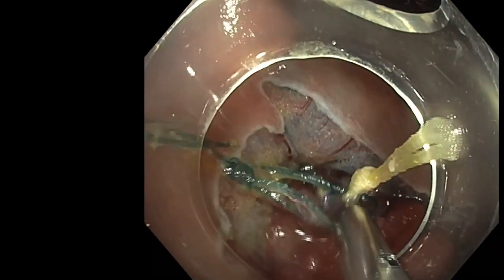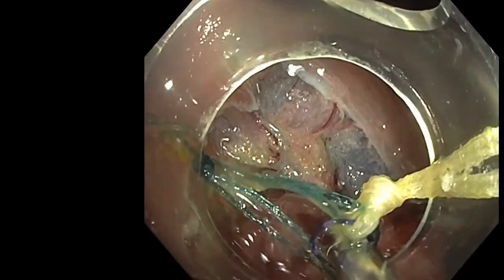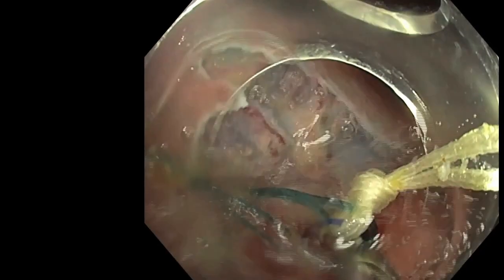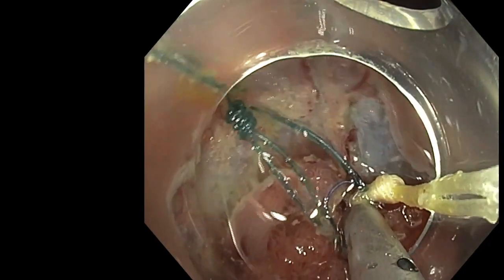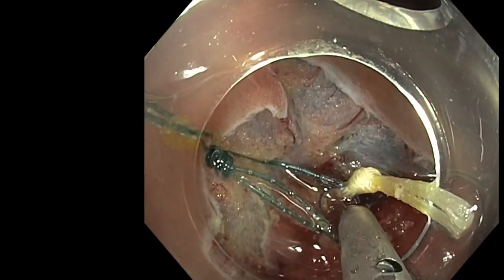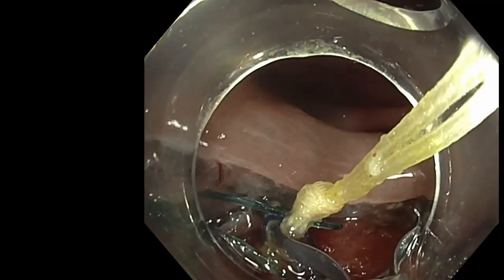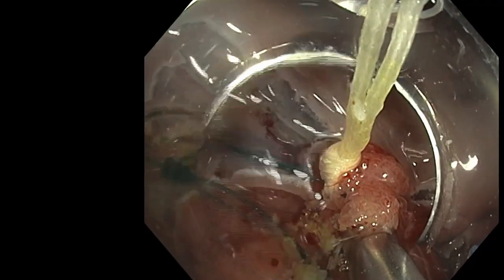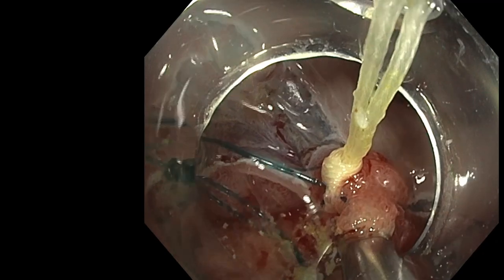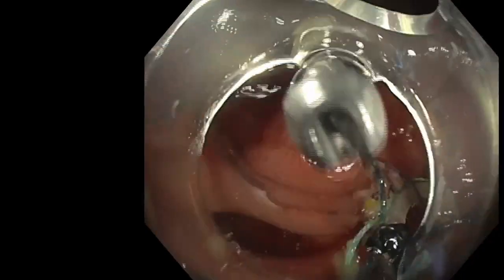So you should have a kind of pulling movement while closing the clip in order to catch the edge but without catching the muscle. Here it appears a little difficult, so I prefer to do it again, to put water in order to have the edge of the lesion, and it will make the traction relatively strongly on the oral edge of the lesion.